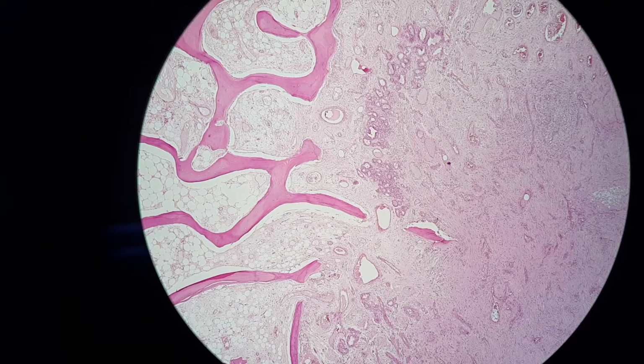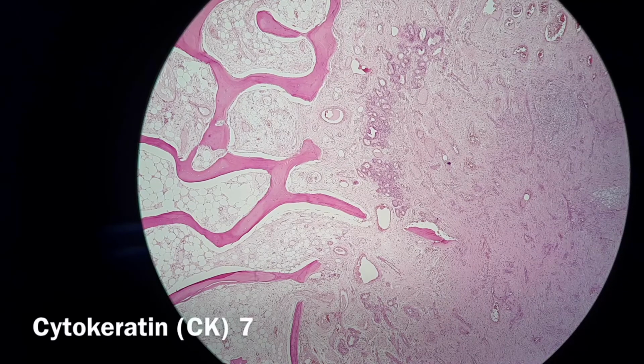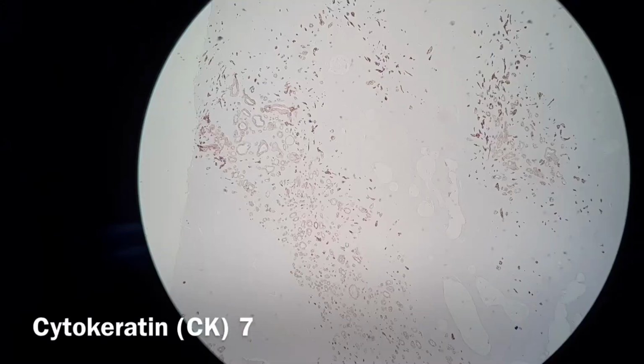Even though the features do look like a follicular carcinoma of the thyroid, we still need to rule out other causes that might mimic the features of thyroid follicular carcinoma. So the first thing that we need to do is CK7. The CK7 will help us narrow down the primary site for this tumor.